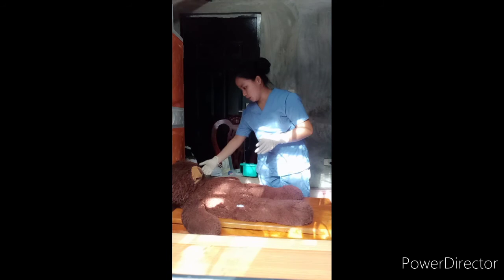And then next is let's readjust the oxygen to the original level if indicated. So original level of oxygen. And then next is let's discard the remainder of the saline appropriately and discard the basin appropriately or rinse and place in a soiled utility room. So let's place.